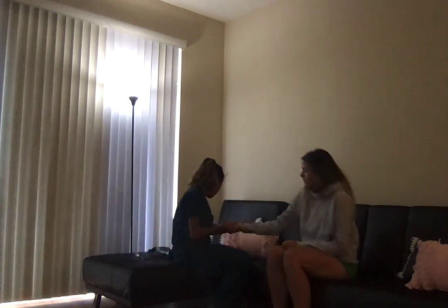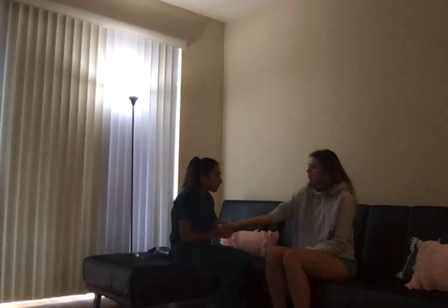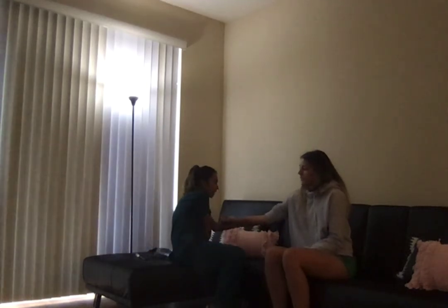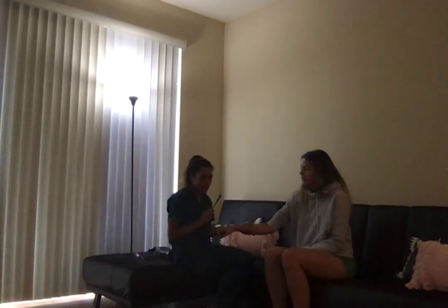Next, we are going to do the deep tendon reflexes. So I'm going to have my patient roll up her sleeve because we are going to do the brachioradialis. So I'm going to take my patient's hand in mine, and I'm going to feel for the brachial tendon, and then with my thumb on it, I'm going to take the reflex hammer, and with the pointy side of the reflex hammer, I'm going to strike my thumb, and a normal finding is that the hand will supinate.